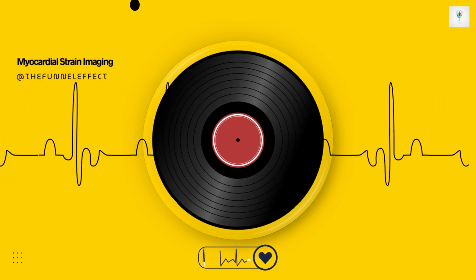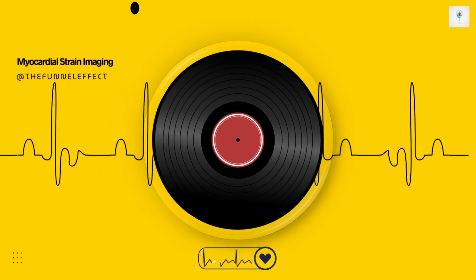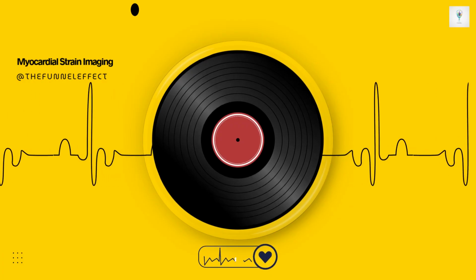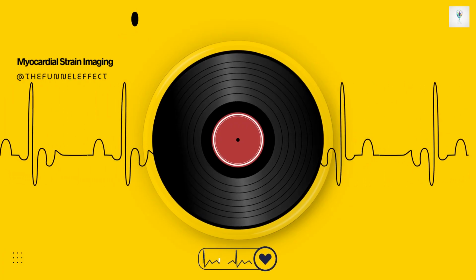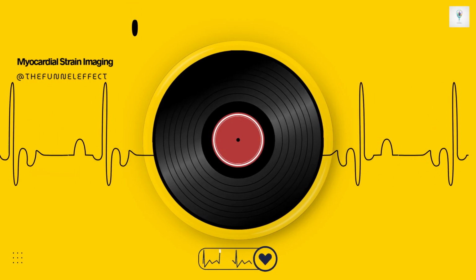So if a segment shortens by, say, 20%. Then the longitudinal strain is negative 20%. The negative sign just tells us it's shortening. Positive would mean lengthening. Okay, so defining that reference length, the baseline, seems incredibly important.